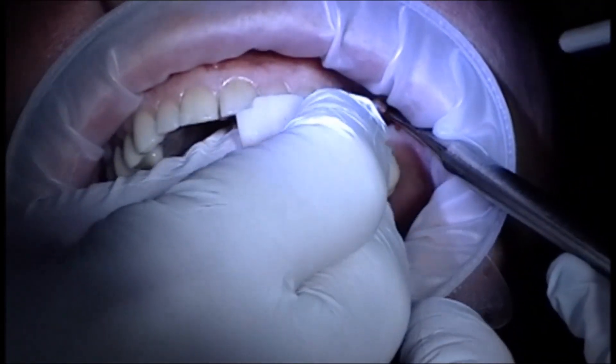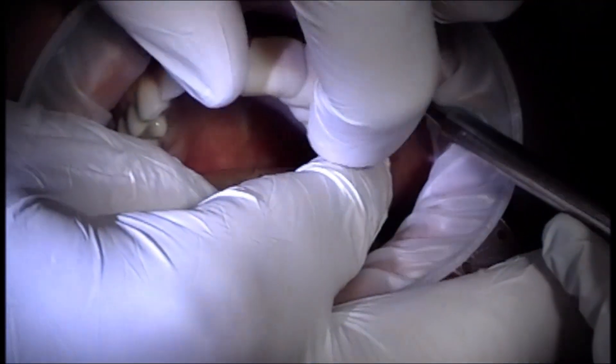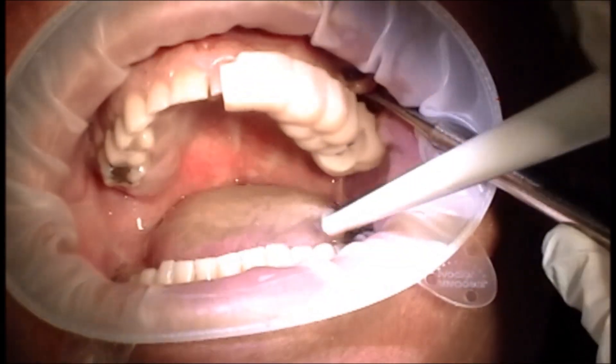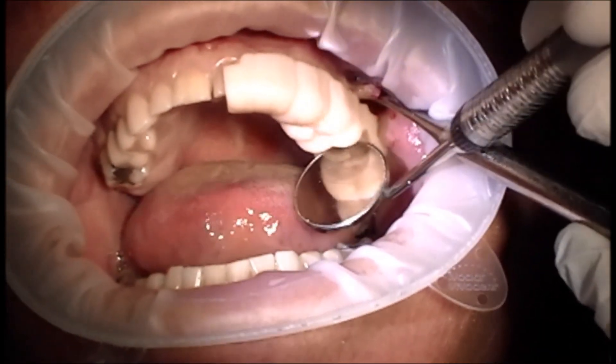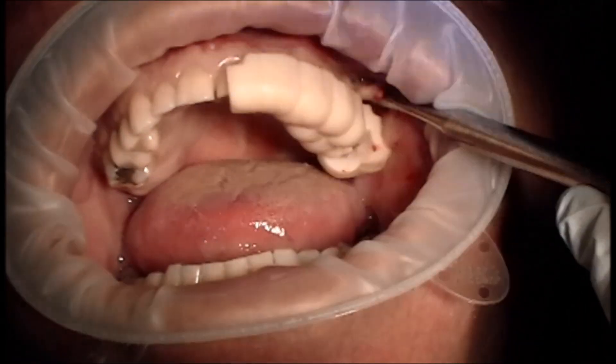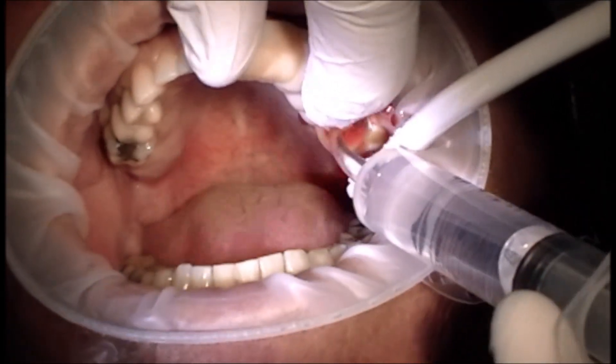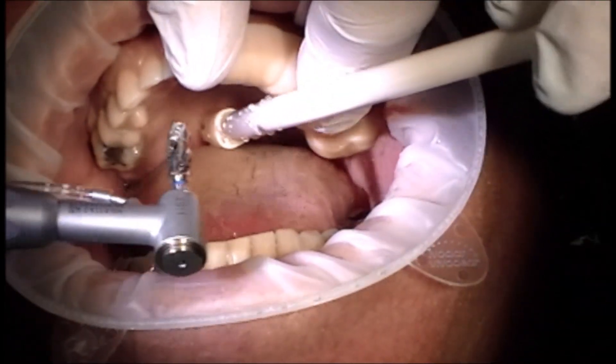Now seat the guide in the mouth — you'll notice this has a very snap fit as I place it on. Press it in very tightly and make sure that it's fully seated. You'll notice I'm visualizing with the mirror the little windows that are created in the guide — this tells me that it's going to be completely seated.